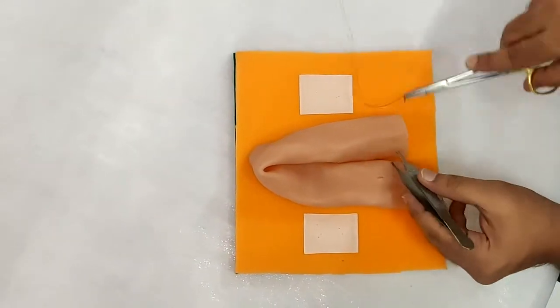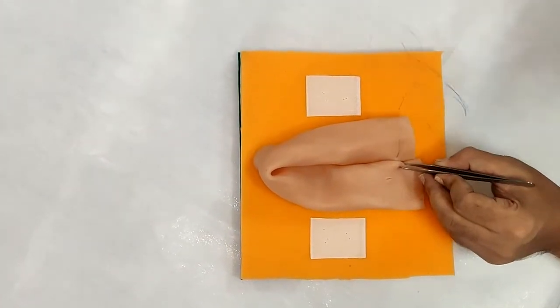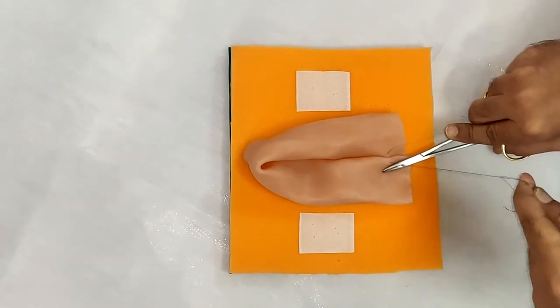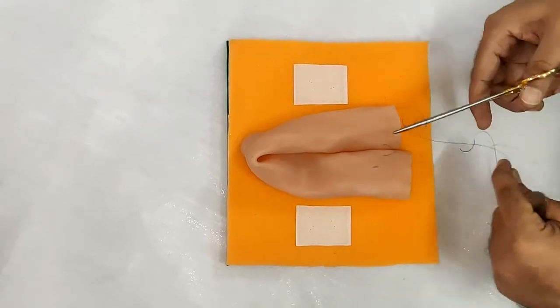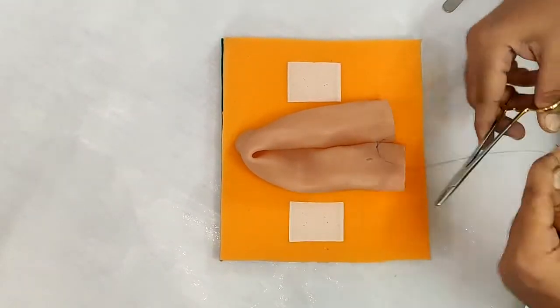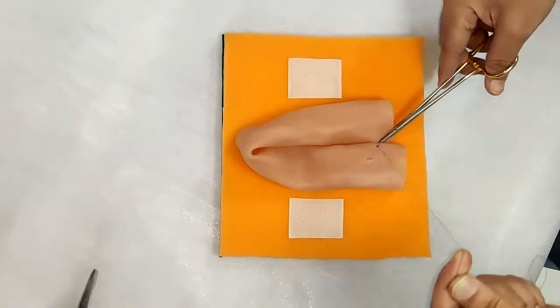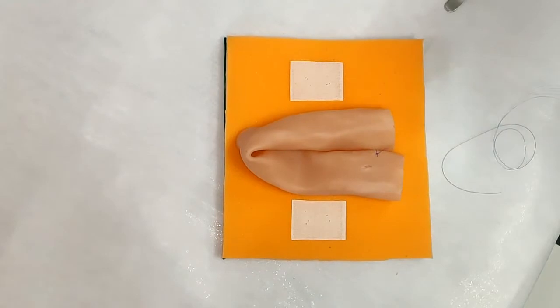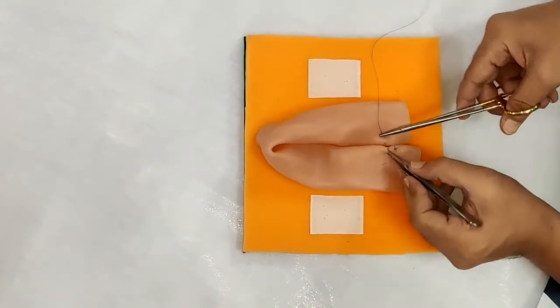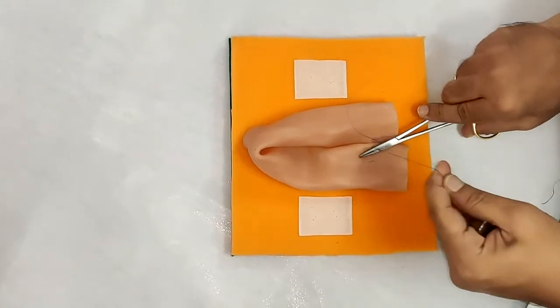Before taking any cuts on the bowel, the first thing is we will fix the two loops together by a simple stay suture, or what we can call a posterior layer of Lambert sutures. We can continue with these sutures for the desired length that we need. Ideally, a 5 to 6 cm length is more than enough for any side-to-side anastomosis.